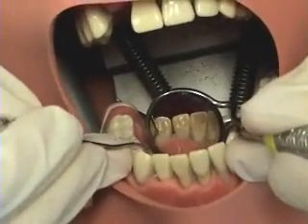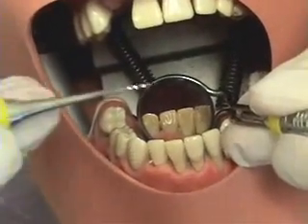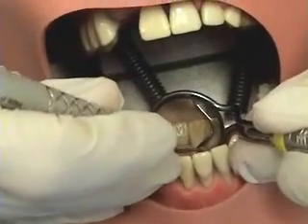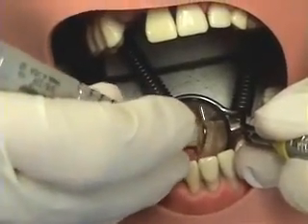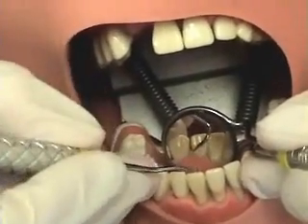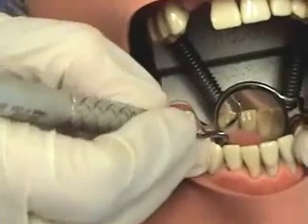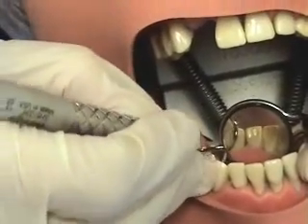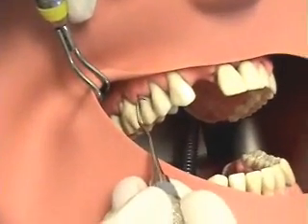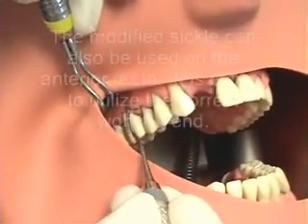Another important thing to remember is that it's the tip one-third that is engaged to remove calculus. Now the clinician is demonstrating the curved sickle — the anterior sickle.